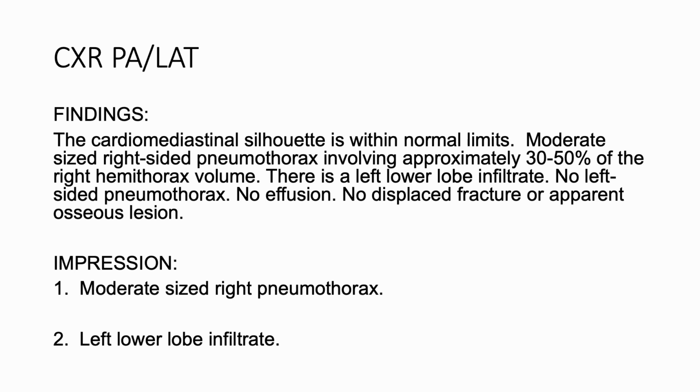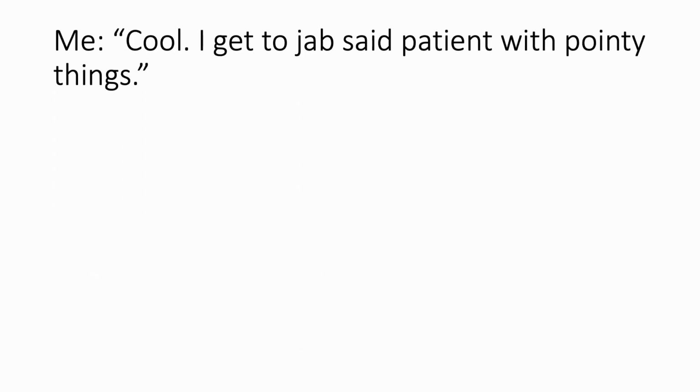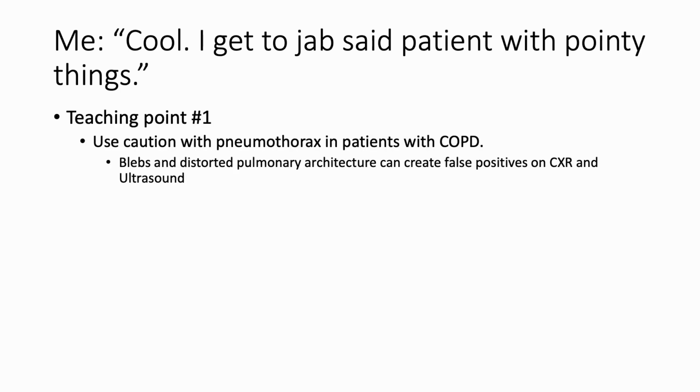So what do I do? I say, hey, that's sweet. I get to go jab somebody with pointy things, which is my typical response in this kind of situation. Which brings us to a couple teaching points that I've developed and learned over the years.